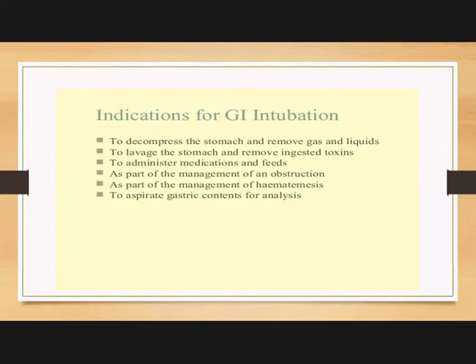As a part of the management of hematemesis, if a patient comes with the complaint of hematemesis, we can pass the NG tube and aspirate the gastric content for analysis.